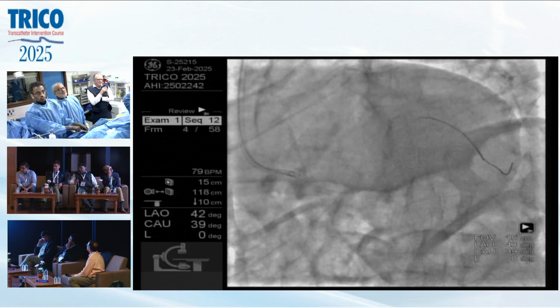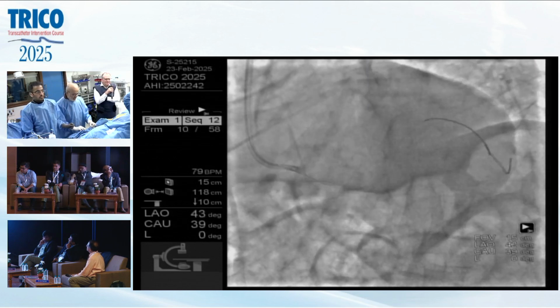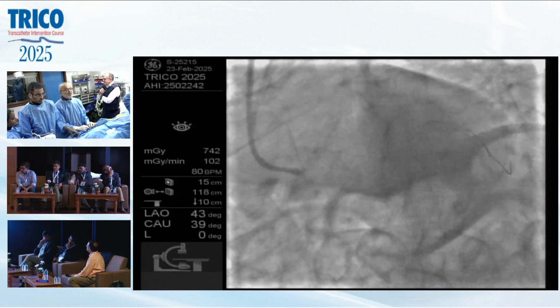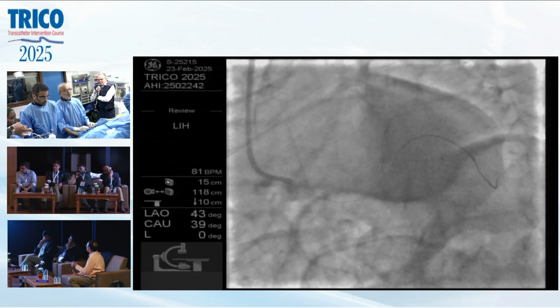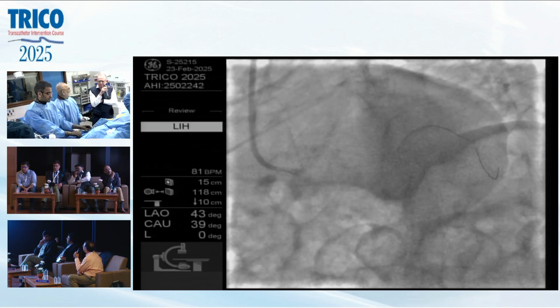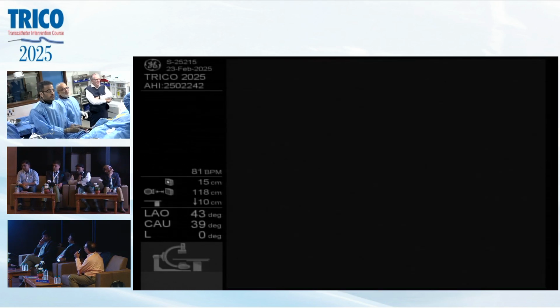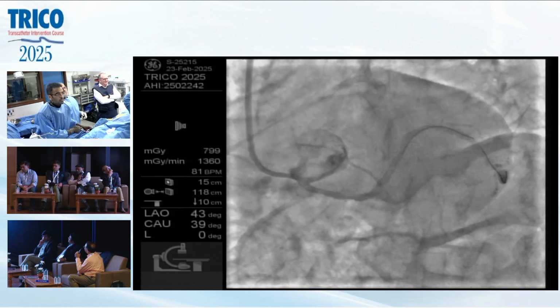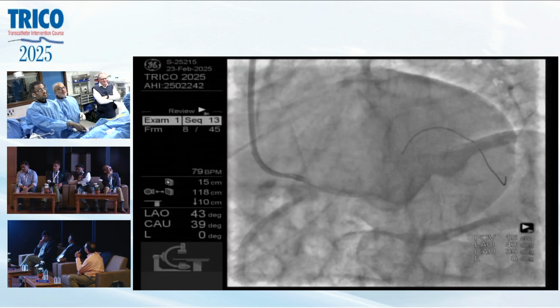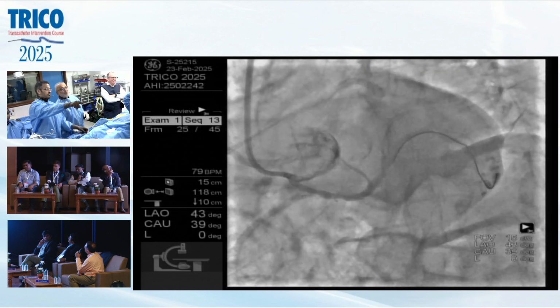So here in that case, I don't need a stent which can be... let me pull this wire back. Would you agree? I think that your son made a good suggestion there. That looks a bit clearer. Yeah, inject. This is a 30 millimeter length of the radio opaque area. I think a 32 or something like that, you think? Or even a 28.